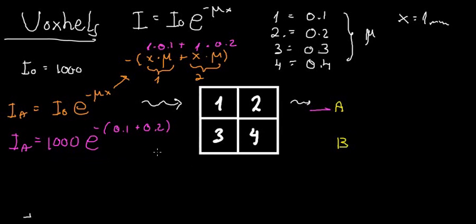This is an easy mathematical equation to solve, providing you have a calculator for the exponent. And this actually was present in quite a few exams. So this is not that hard, and I can ask you to calculate the intensity going through here. What you need is to add number 2 and number 4, and you can call this D or C or whatever you want.